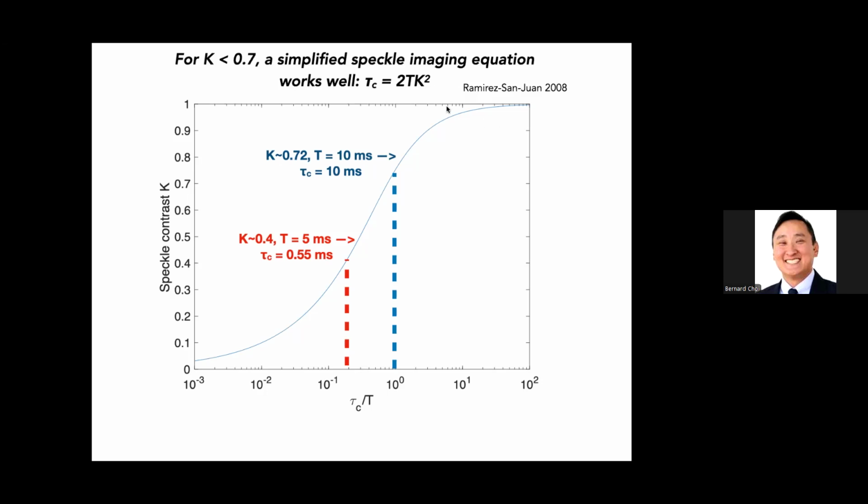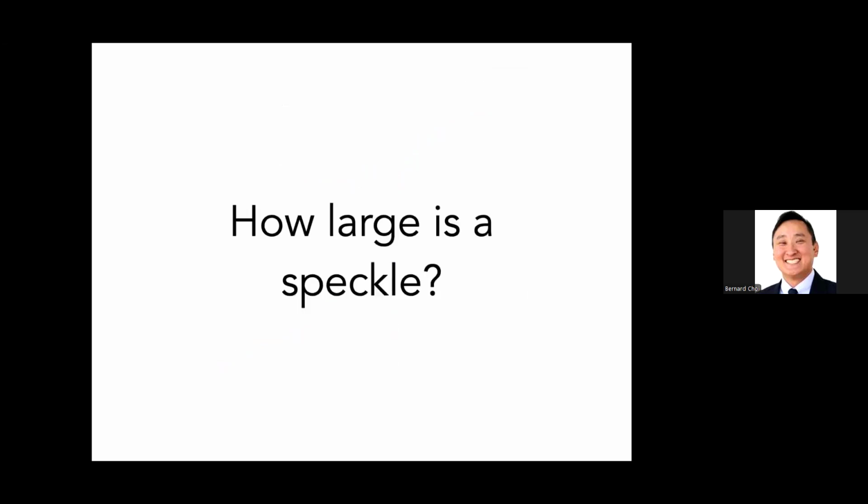This is basically a quadratic, so it'll have a different shape to it, but for a large number of, basically this contrast down, if your contrast is in that range, you can just use this equation. Oh, sorry. Used to find contrast, that's the standard deviation over the mean. So that's a sliding window. Yeah, like what Christian showed earlier.